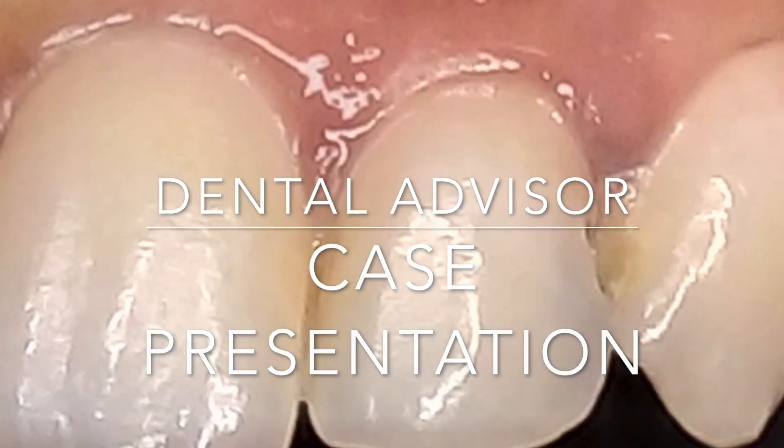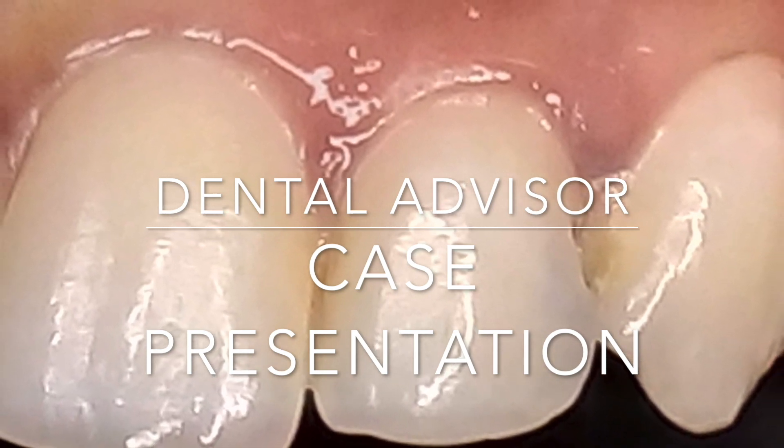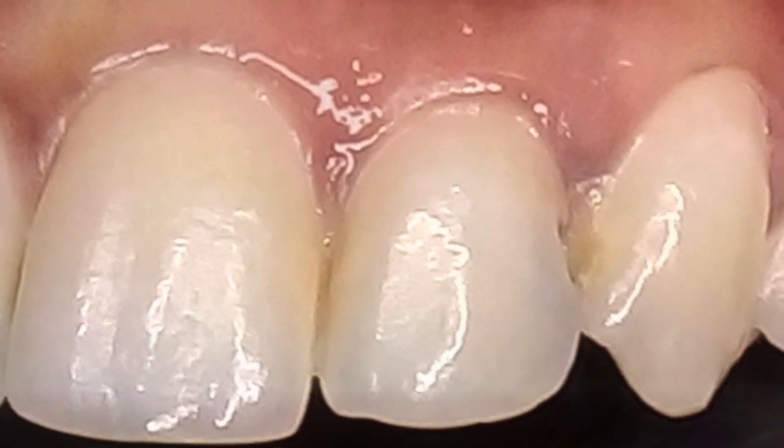Hi and welcome to another session with the Dental Advisor. Today I'm going to show you a two-minute case presentation on how to do a class 3 restoration using light-cured composite with the bio clear method.